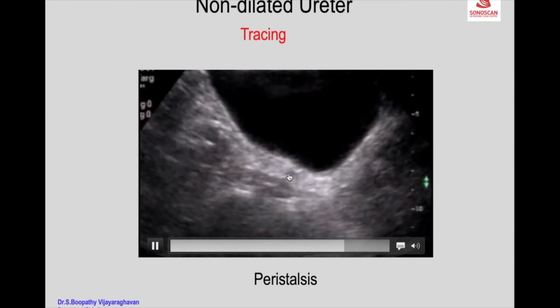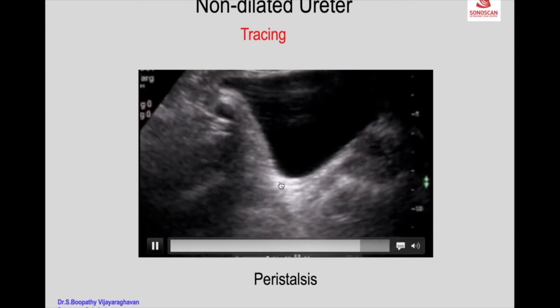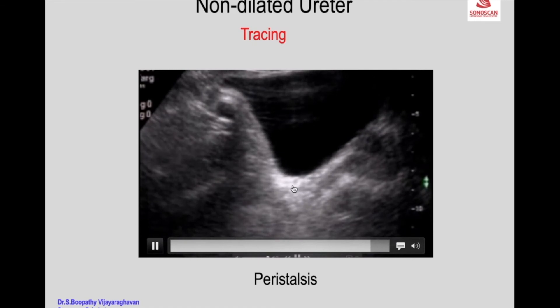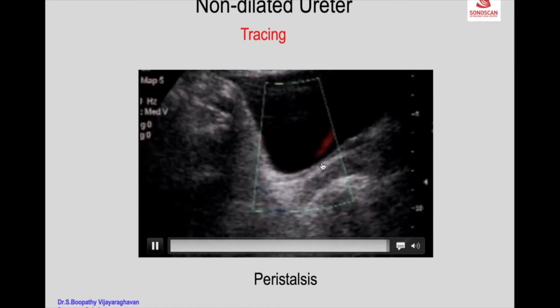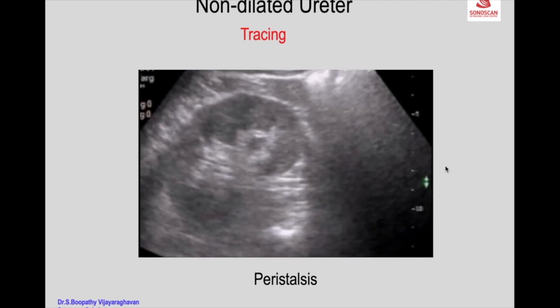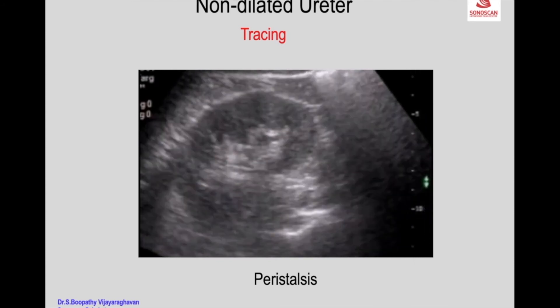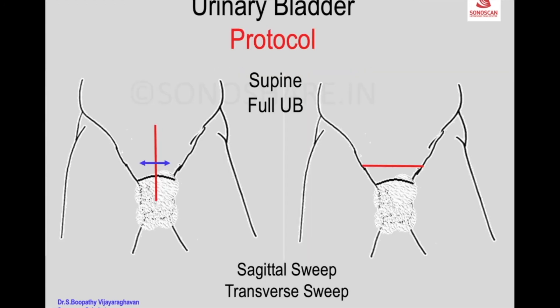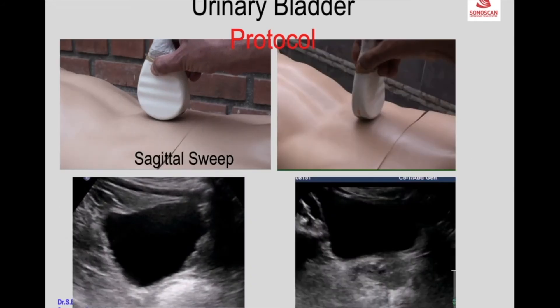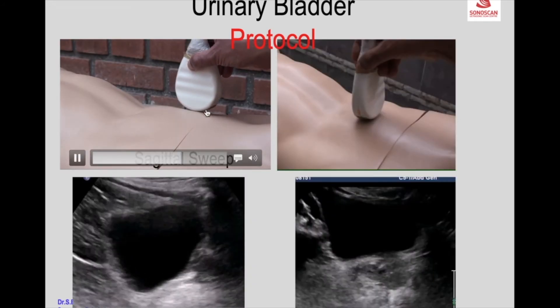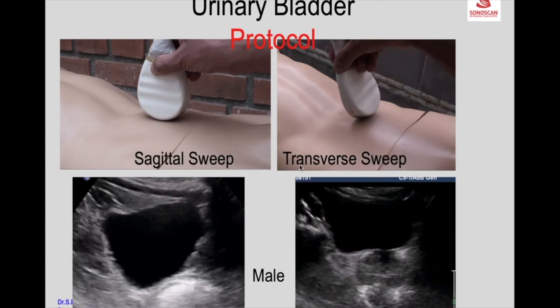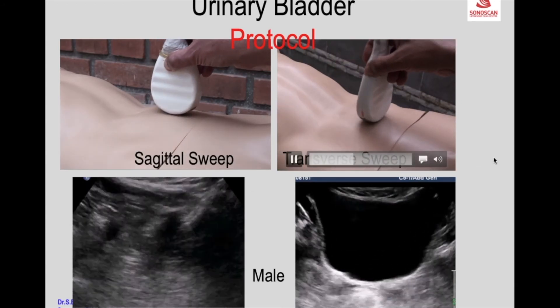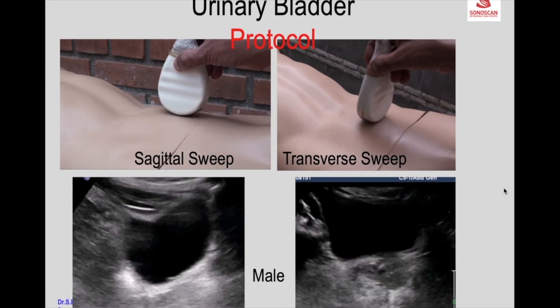This helps us to identify and confirm that it is the ureter. You see the distal most ureter collapsing, and then you can put on color to see the jet which follows the collapsing of the distal most ureter. Then rotate 90 degrees, make a transverse scan, and perform an up-and-down transverse sweep so that you scan the entire volume of the bladder. That is the sagittal sweep in the suprapubic region, and the corresponding transverse sweep can be seen in a male patient.